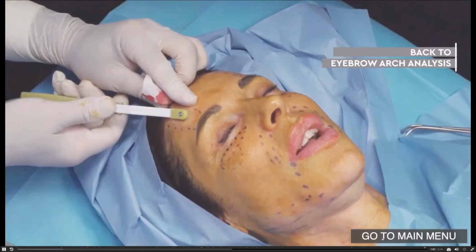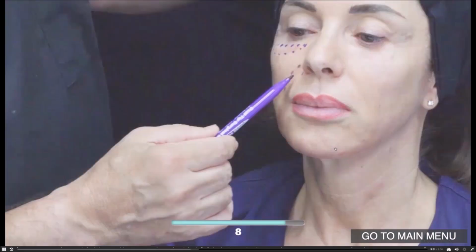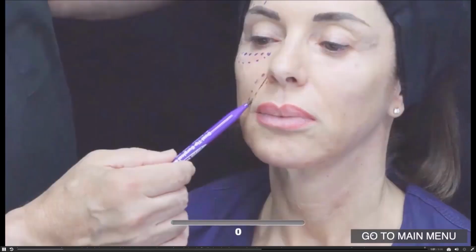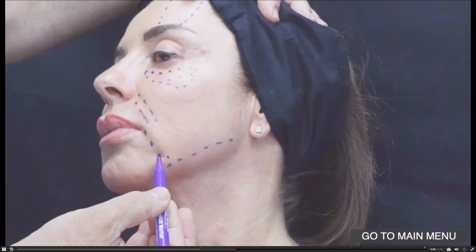Now I want to show you the treatment of a nasolabial fold. I go and I see the marking, and I decide what you go, anesthesia or the treatment. If I go to main menu, I press, go to main menu. I go to the treatment of jawline, for example, I press, and I can have a choice. What I can do, anesthesia, treatment, or the anatomy. If I go on the anatomy, you can see the anatomy where you are treating.